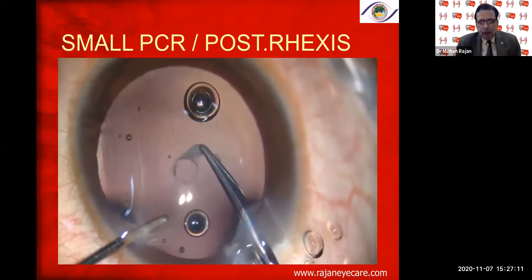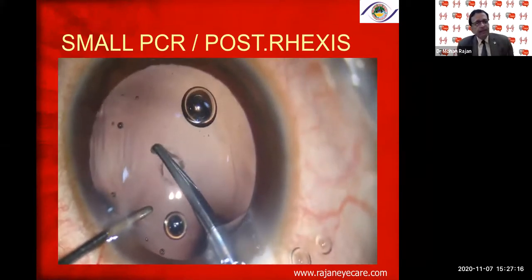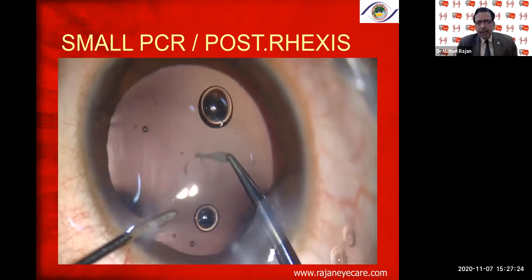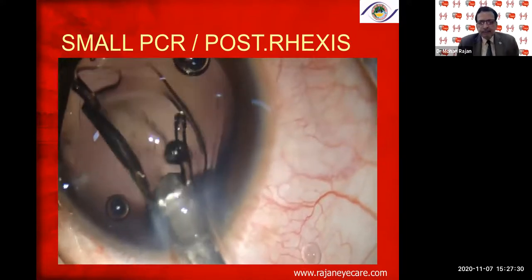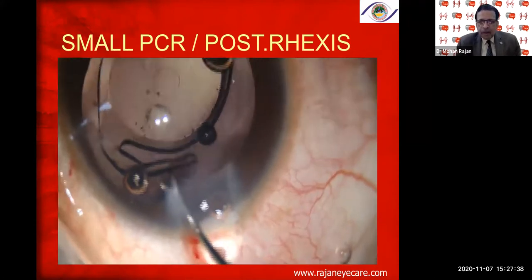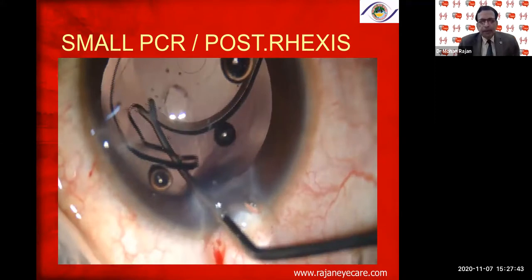Again, if it's a small PC tear, you can convert that into a posterior capsular rhexis. This is, I think, a very important thing. Don't try to put a lens without converting that into a posterior rhexis. You can see the small PC tear, I'm trying to convert that into a small rhexis, and going ahead with putting an in-focus lens, which is an extended depth of focus lens, which is made by Appaswamy, and the patient did very well. When you convert a small PC tear into a posterior capsular rhexis, you can go ahead and put a lens in the bag without any problem, without the fear of any extension of the posterior capsular tear into the periphery as well.